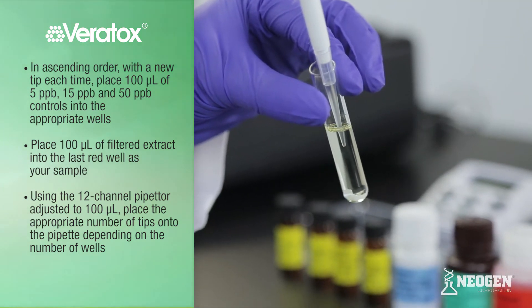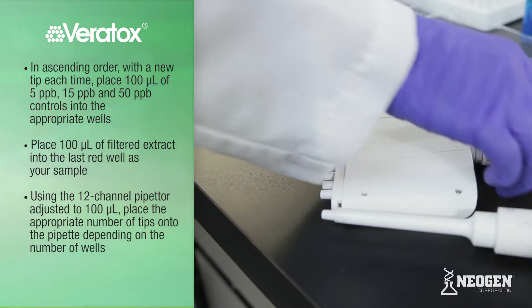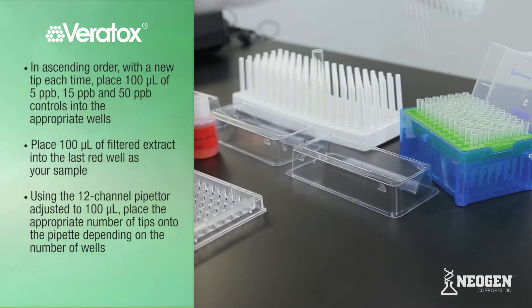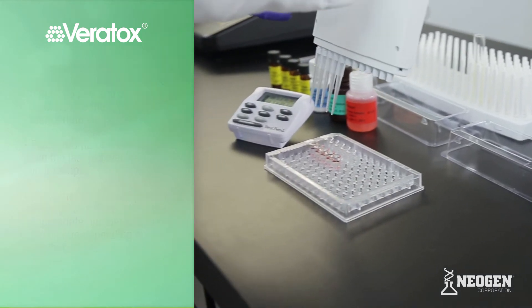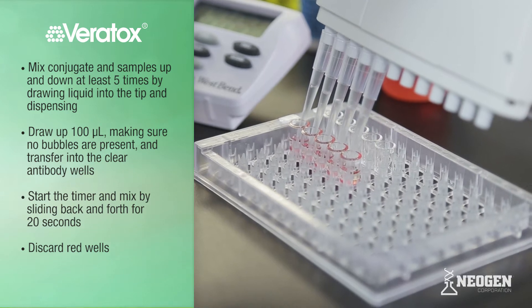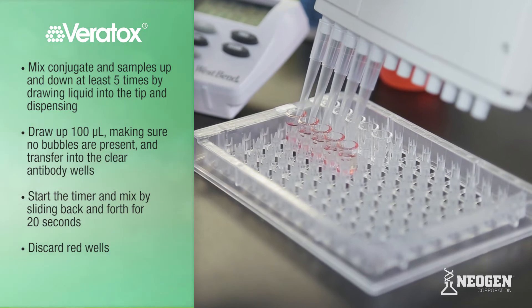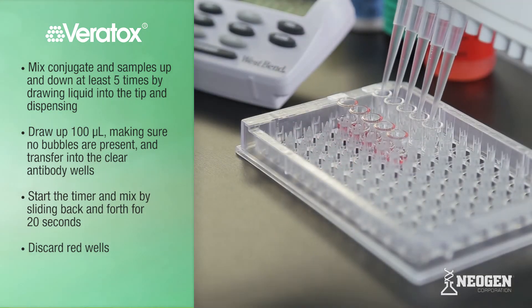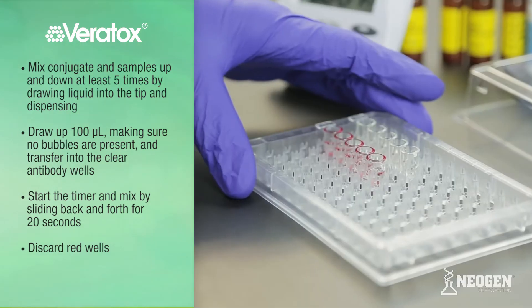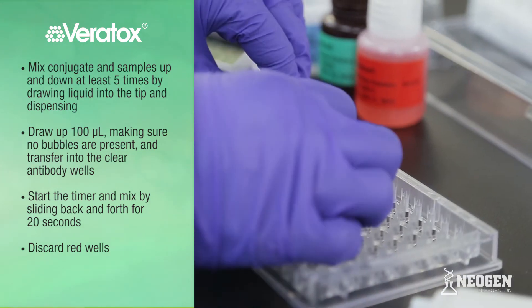Place 100 microliters of filtered or diluted extract into the last red well as your sample. Using the 12-channel pipetter adjusted to 100 microliters, place the appropriate number of tips onto the pipette. Mix conjugate and samples up and down at least 5 times by drawing liquid into the tip and dispensing. Draw up 100 microliters, making sure no bubbles are present. Transfer 100 microliters into the clear antibody wells. Start the timer for 2 minutes and mix by sliding back and forth for 20 seconds. Discard the red wells.